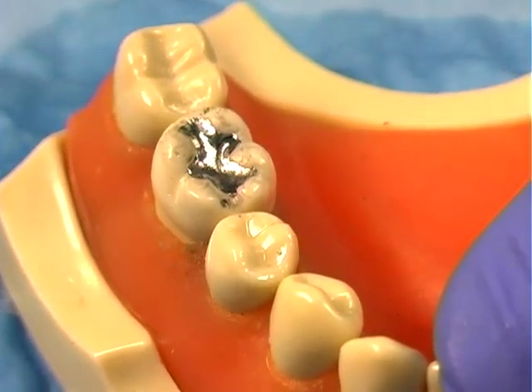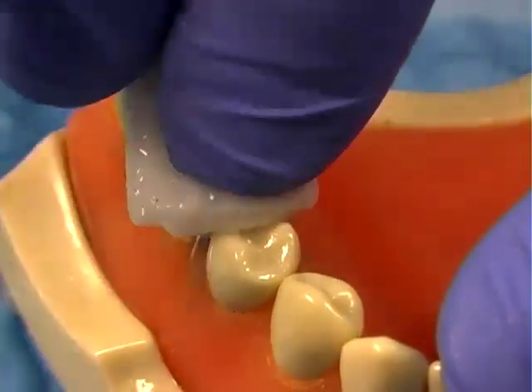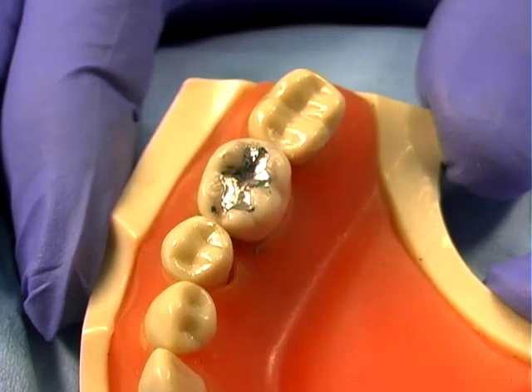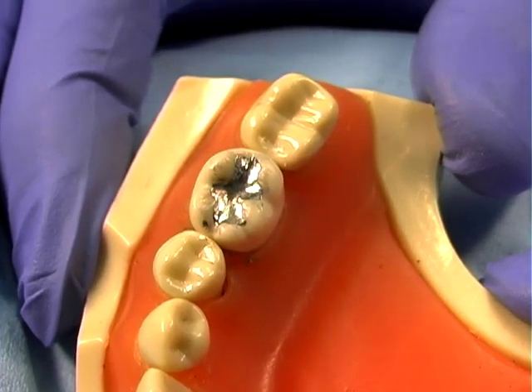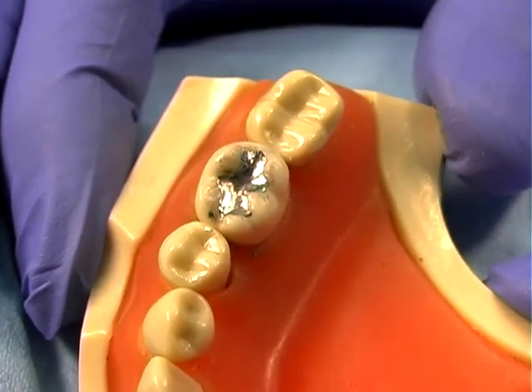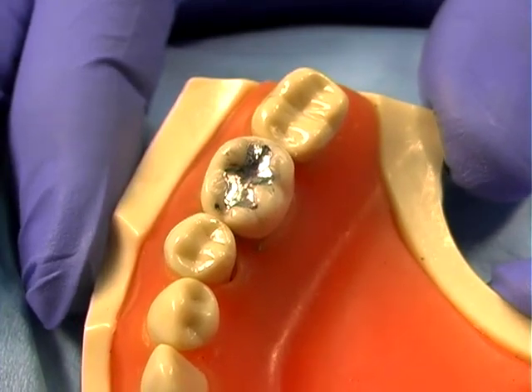Use the super greenie cup to polish the cusps of the occlusal surfaces and the interproximal surfaces. Rinse with water to cool and to clean. Inspect the surface for a high glossy shine that should look like a piece of aluminum foil. The finished amalgam should be smooth and have no visible scratches or rough margins.